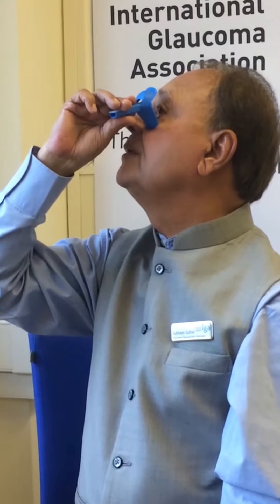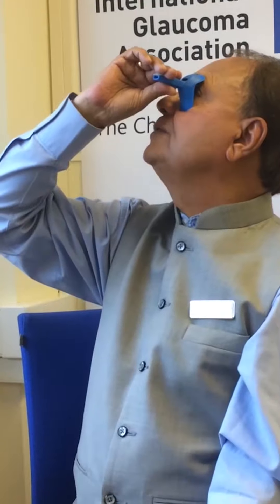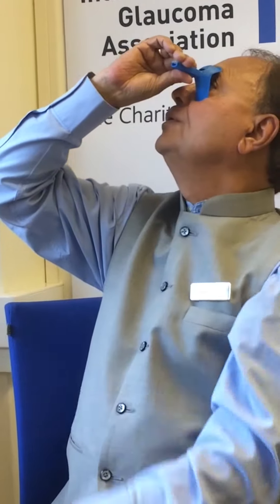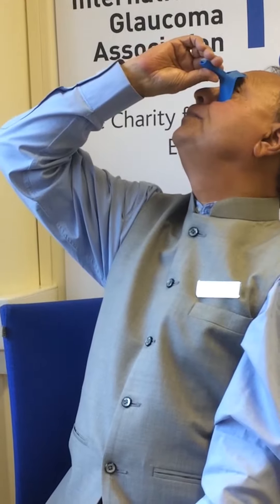With the lower part you pull down your lower lid, place the upper part on the brow, look into the hole, lean back, and press. You can do it with both eyes if needed. The drop will fall exactly in your eye. Then find the corner of your eye and press gently for a minute to prevent the fluid going down into your mouth.